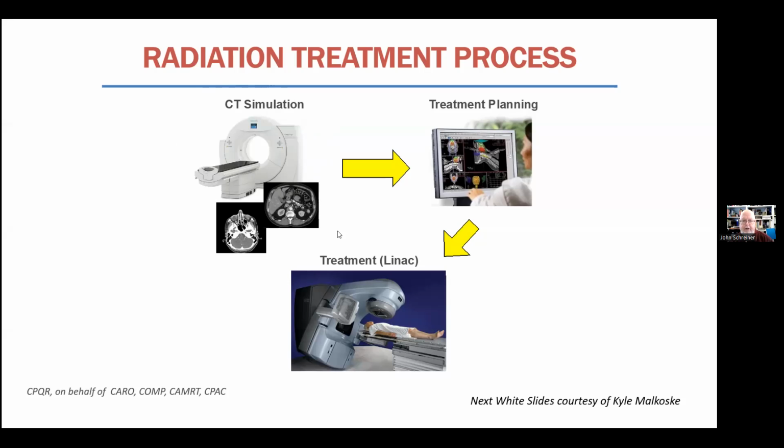So this is now a three-dimensional treatment simulator, either a CT scanner, a computed tomography scanner, or perhaps even an MRI, magnetic resonance imaging scanner. And that enables a much more detailed look at the internal structures and the various organs that we're trying to treat. And actually, I'll say a side thing that I wasn't planning to say.